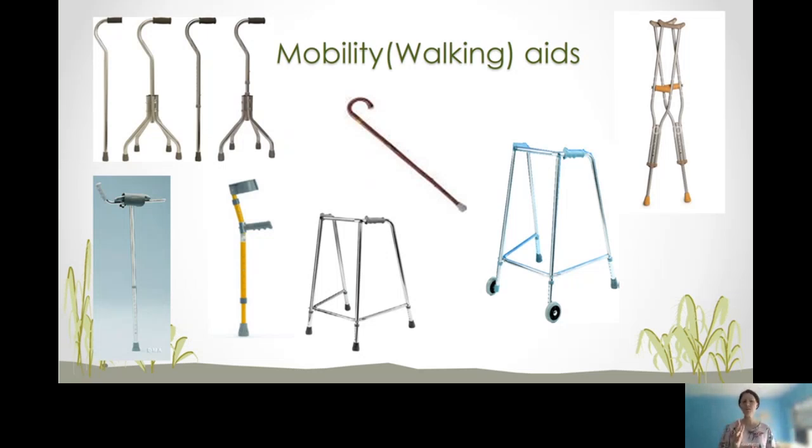Can you tell me, what do you think, why will we issue a quadrupod for somebody compared to just a normal walking stick or a cane? Can you answer that? Why don't you write it down and tell me? Be sure to list base of support, center of gravity, and examples of injuries and conditions where you will rather prescribe a quadrupod for your patient.